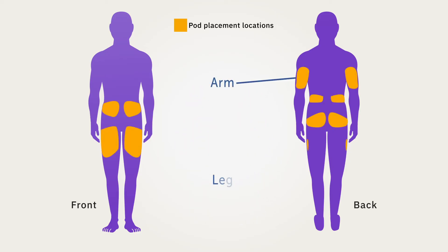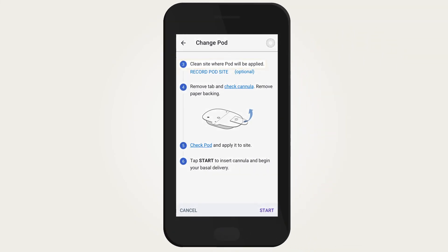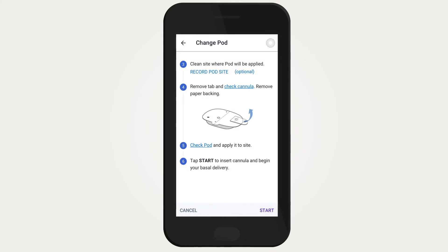Now select a pod infusion site. Ideal locations for placement include arm, leg, lower back, buttocks, and abdomen. Try to place your pod in direct line of sight to your CGM and avoid placing it on the opposite side of the body from where the CGM is placed. Once selected, clean the pod infusion site and make sure the site is completely dry before you apply your pod.